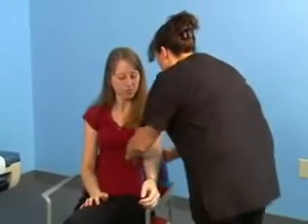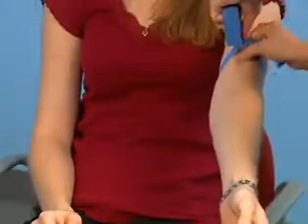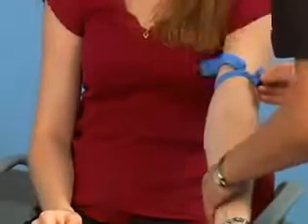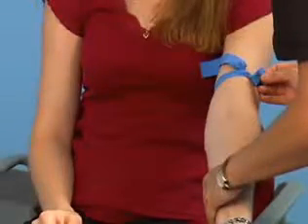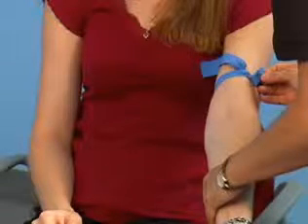Apply the tourniquet 3 to 4 inches above the bend in the elbow. Make sure the tourniquet lies flat against the patient's skin and does not pinch the skin. It should be snug but not tight. Ask the patient to clench her fist. The combined effect of the tourniquet and the clenched fist causes the antecubital veins to stand out. This makes the veins easier to palpate.